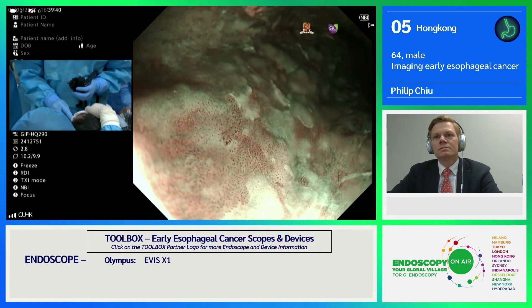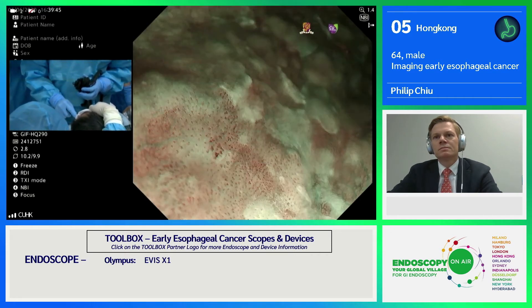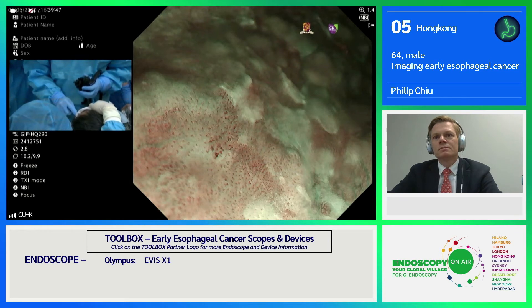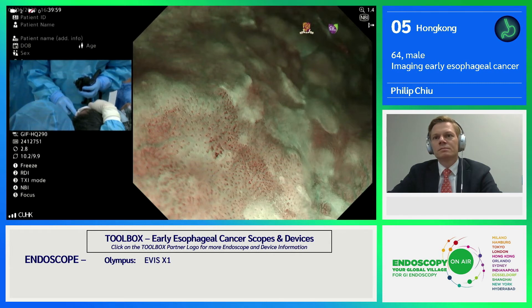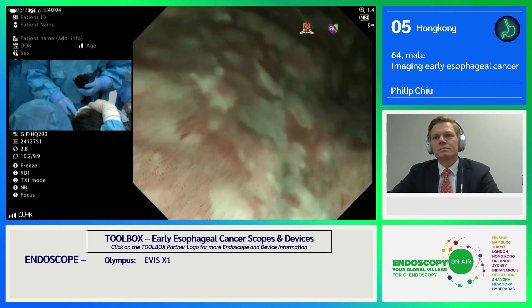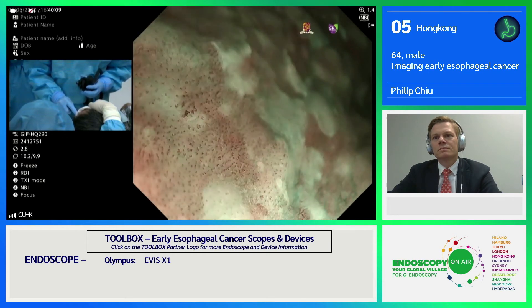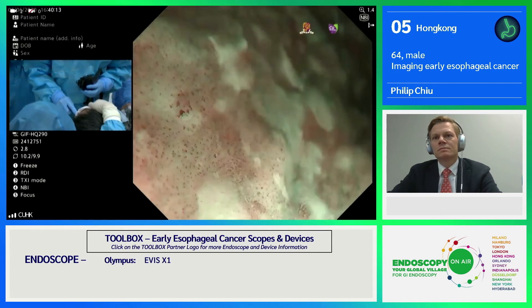Using digital zoom to look more closely at this IPCL pattern, it is compatible with a dilated loop pattern — an irregular dilated loop pattern probably classified as JES B1 — with a distinct border of the lesion, more compatible with dysplasia. We can generally observe skip lesions in patients with high-risk factors like chronic smoking and drinking. This helps us to stage the disease better.